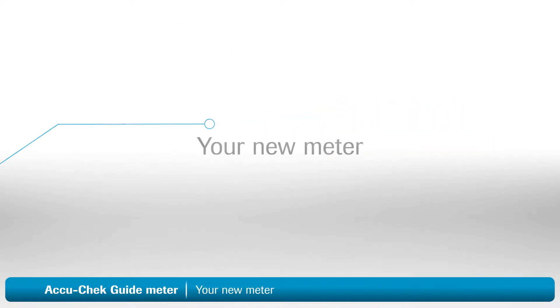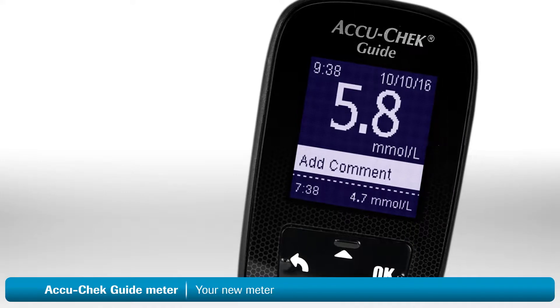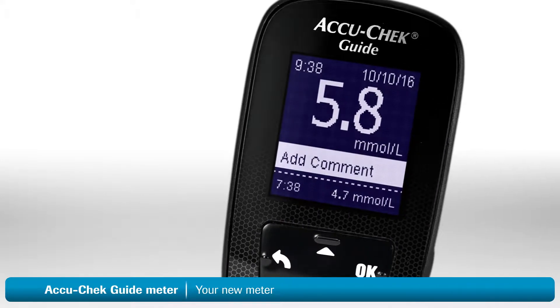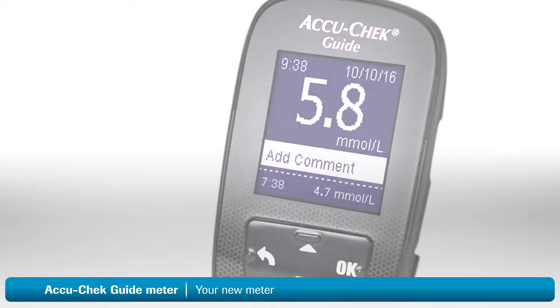In this video, we'll walk you through setting up and using your AccuCheck Guide blood glucose meter. If you're worried about learning the steps involved, don't be. This video is divided into small sections, so if you miss anything, you can always go back and watch that part again.